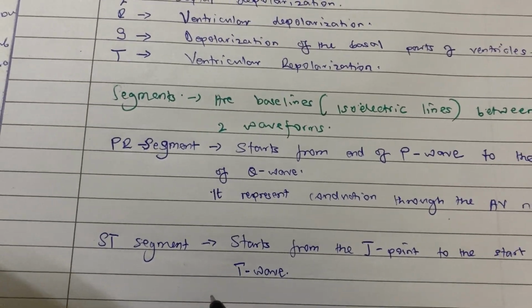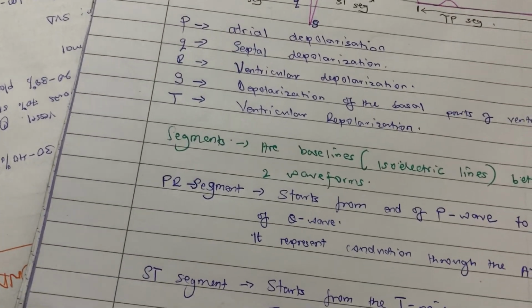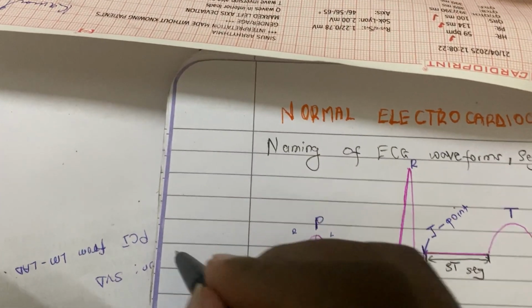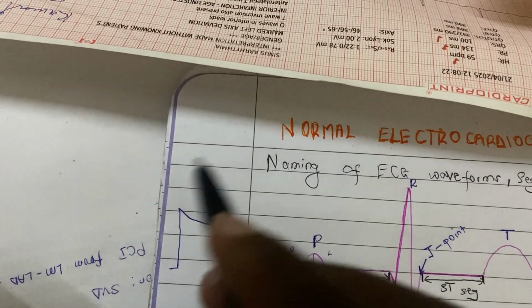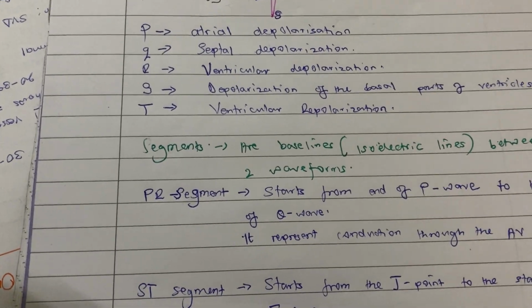What does it represent? Remember the depolarization waveform, like graphically. Remember we did this. This is depolarization. You do something like this, and then we say this is phase 2. So it's ST segment. It represents phase 2.